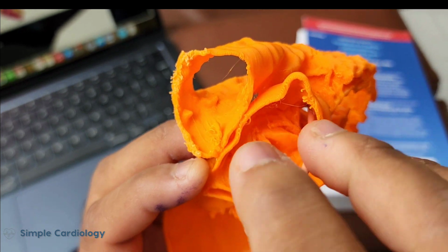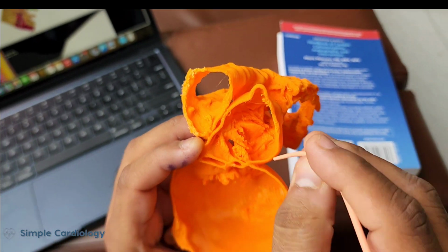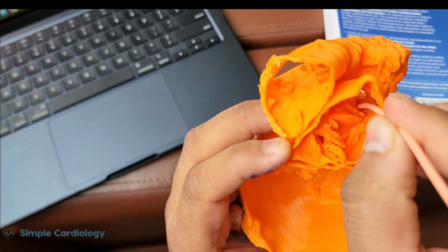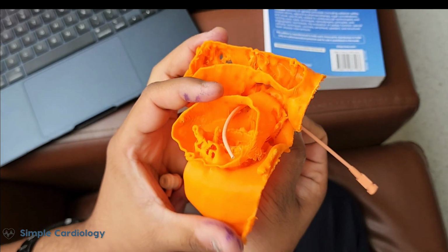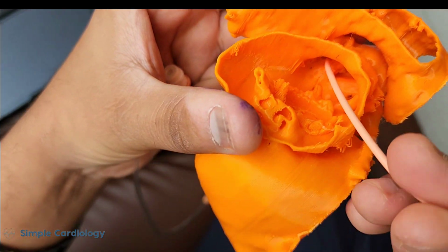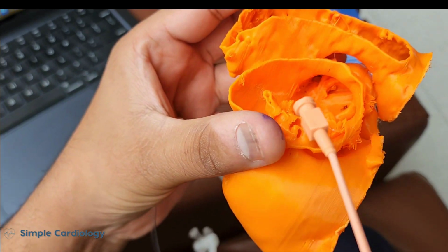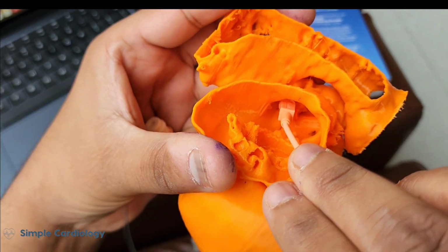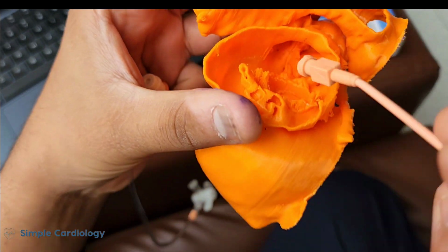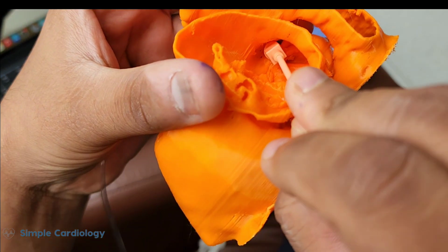That is also understood by doing a 3D printing, because this leak goes very easy to go inside. But we will have to give a bend to the catheter, use a JR and look posteriorly to go into the paravalvular leak. And you see that it is an oblong defect here, and it is very difficult to size it. But overall, this is almost completely occluding it with small space around it. So maybe if this is 6-7, we take a 12 mm device, it will be completely able to close it.